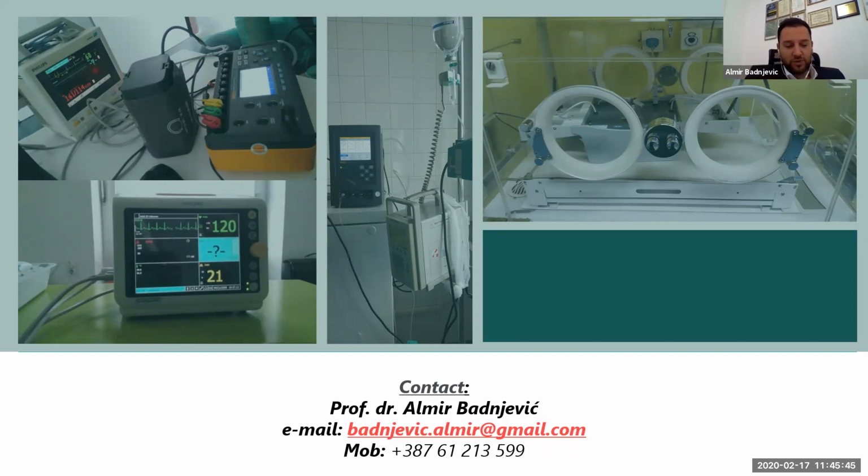And most of those devices, let's say those modern medical devices, are all made by software. So you are checking all the sensors. Is it working well? And if everything is going well, they are not touching anything. If there is any kind of error, they go to another point, then they are measuring, they are opening devices, and they are measuring why some sensor is not working well, what they should do, etc. When they find out which one is not working very well, then they even do the calibration of those devices. They are drifting some of those points, they are changing some currents on the potentiometer, etc., etc.